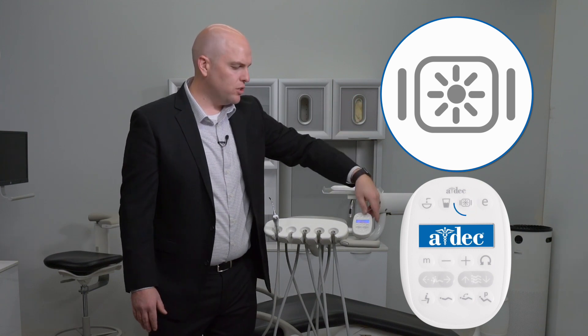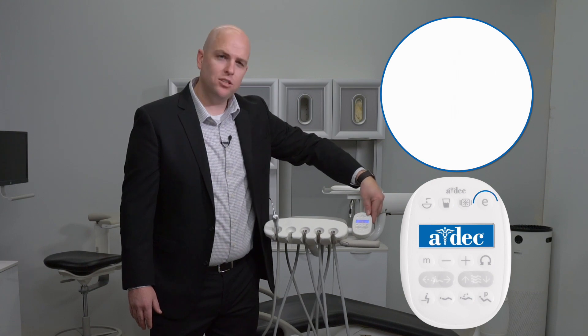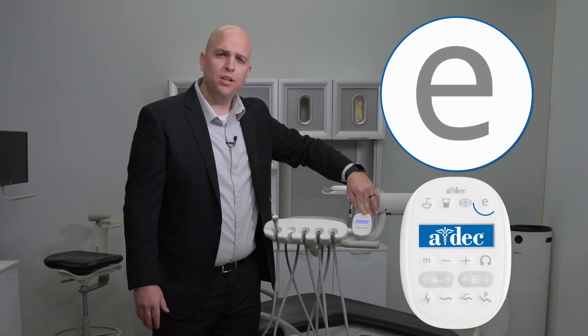Next, you have the light button. If you have an LED light attached to the chair, wall, or ceiling, you can turn the light on and off by simply pressing that button. Next, you'll see an E — this is how you enter endo mode if your handpieces support that functionality.